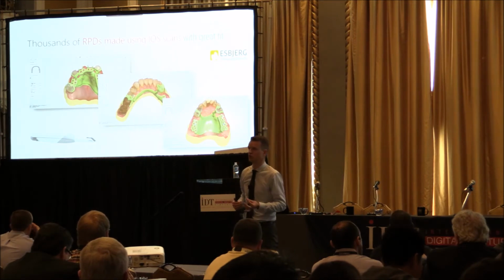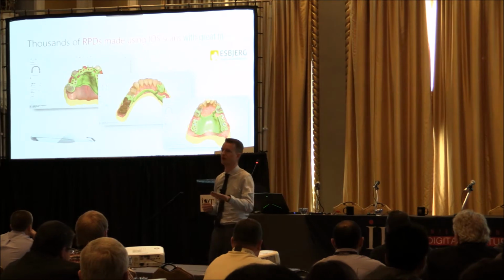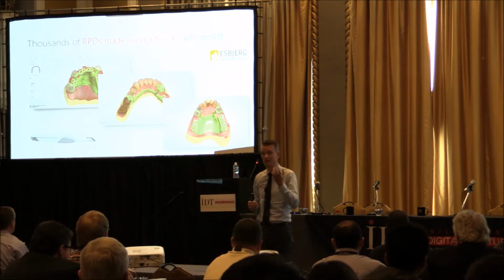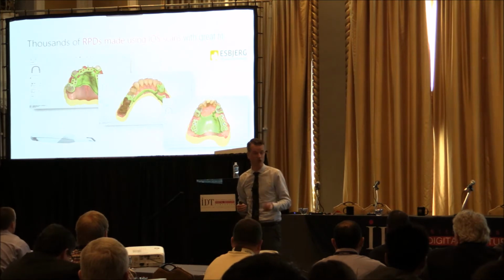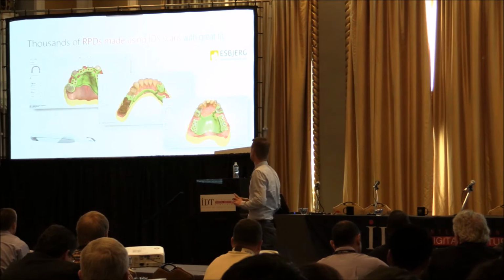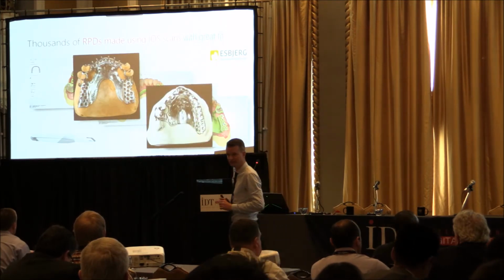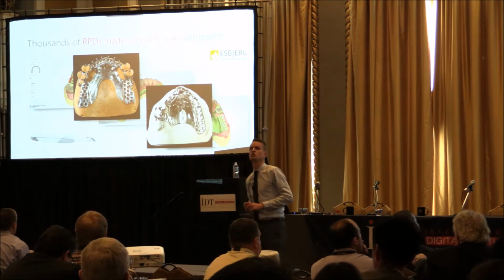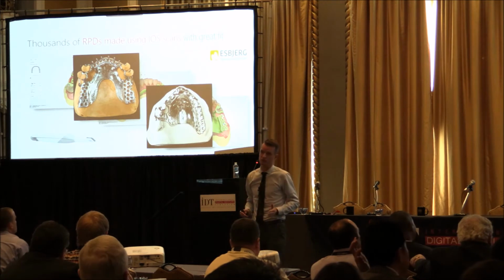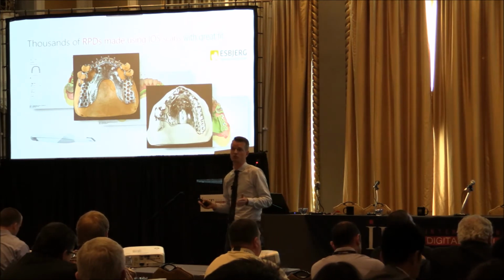And it's really good, because you have no pressure on the gingiva. You don't retract teeth. So I actually don't think you can make a better impression than with an intraoral scanner when it comes to RPDs because of the workflow. All right. This particular lab is also laser sintering all their cases. So that means metal printing. So they are metal printing all their cases. They are saving 70% work time compared to the manual workflow that they had a year or two ago.